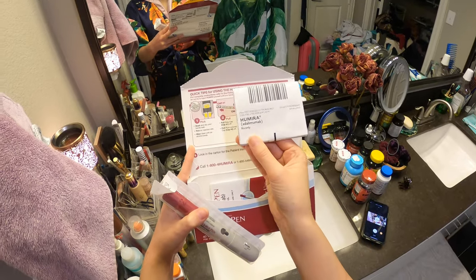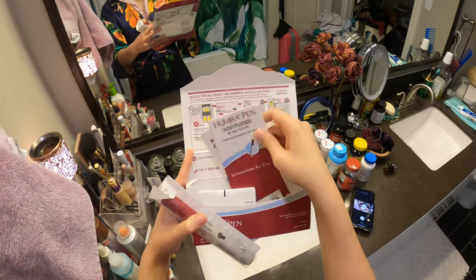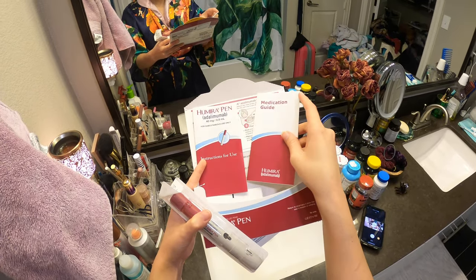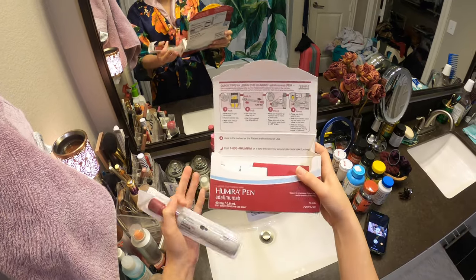You've got your medication information, your instructions, and a guide. This comes with every pack if you ever forget.